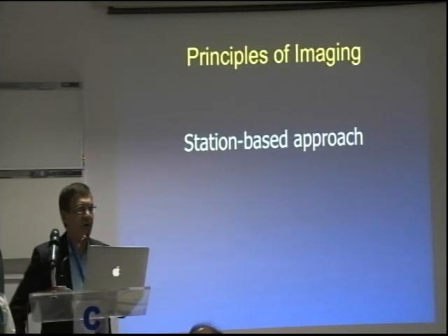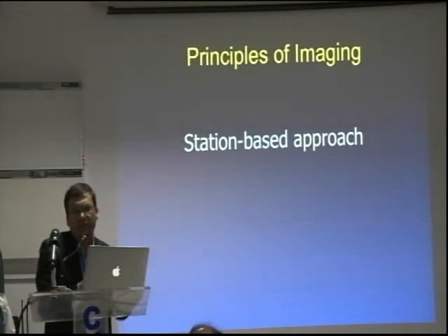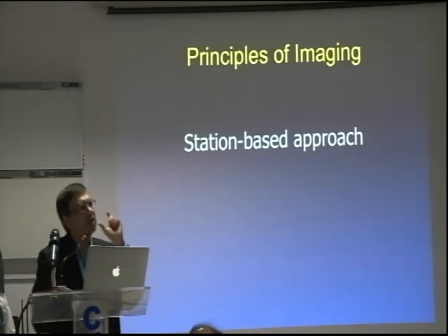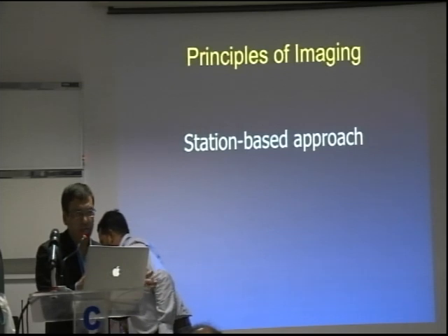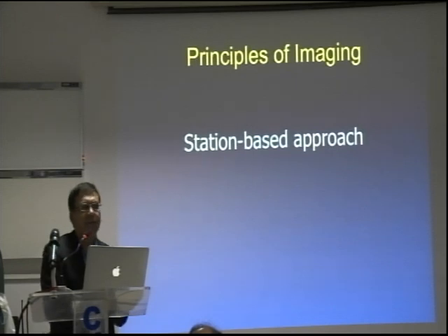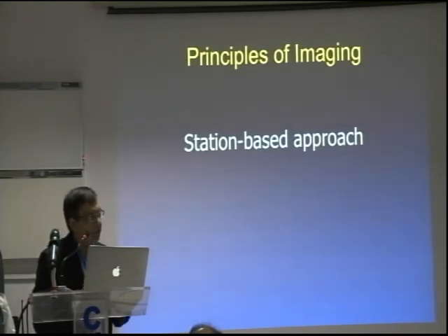If the patient is problematic in regards to the medical condition, unstable, or has too many comorbidities, then I go to the target first right away, evaluate that, and if time and patient condition permit, then do the rest of the complete EUS examination. But if it's a reasonable patient and you can spend time, then I go through the steps. And I make my fellows every time start from one point and completely finish it.